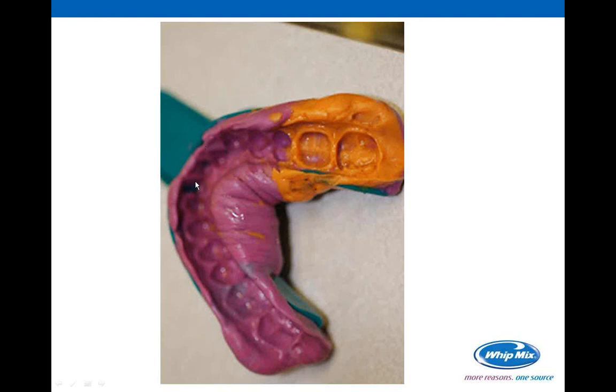First of all, can you see how close the anteriors are to that tray? And there's probably a little bit of show through right in here. So we banged into the anterior teeth with the tray, which very well could have dislodged what we were doing in the posterior. But the other problem is, can you see the tray show through and where it is? Right by your margin. So I don't know that this is an accurate margin, because as we press this little plastic tray down, it could have flexed this direction, and then as we pulled the impression, it pulled back, and now you have a whole distorted area that's going to be here on the lingual side of the impression. So this is one that you'd have to pick up and discuss through your communicator to the doctor.